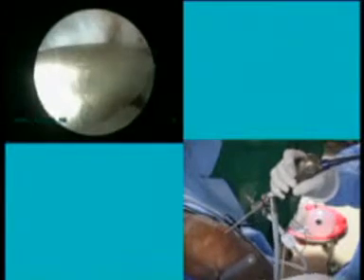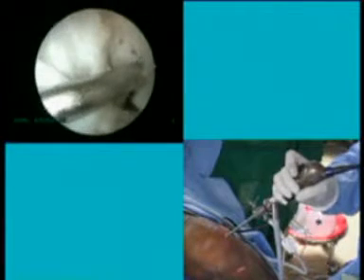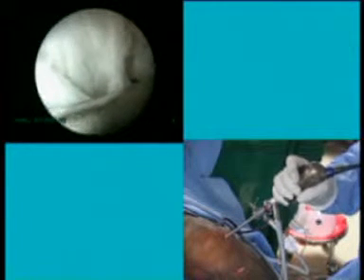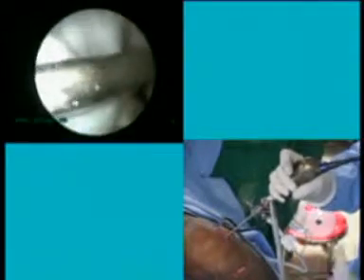Yeah, I can feel it. Okay, then out. Okay, then you can go on. I use a 4.5 millimeter drill. Yeah. Should we do that? Yeah, so I think you please go ahead. We'll just come back to you in a moment after seeing the tunnels made by the other surgeon.